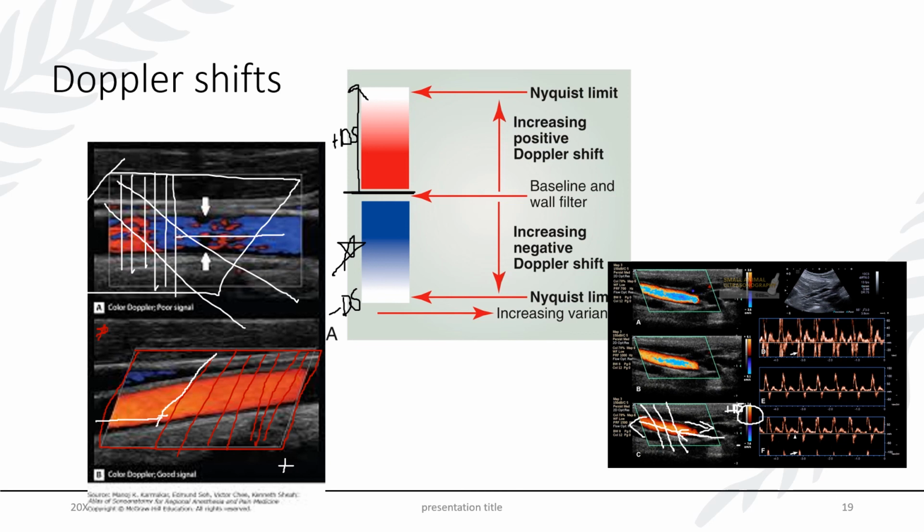You'll notice that we're getting some blue in there. Now, oftentimes that could mean turbulence. It could mean a number of different things. It could be there's a stenosis, something significant. In this case, what it simply means is that our scale is not set large enough.